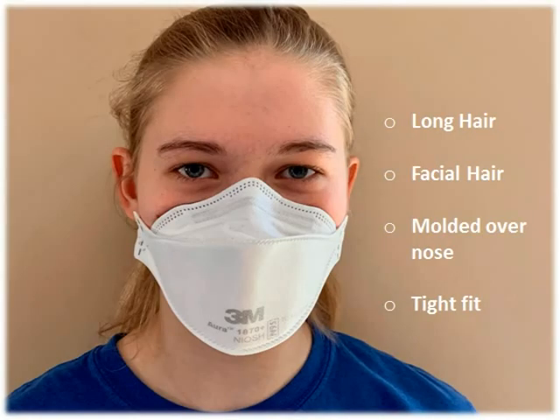A person with facial hair may have a difficult time obtaining a correct fit, and facial hair along the seal lines of the respirator will cause the respirator to leak. The person must be clean shaven, especially along the seal lines. In addition, long hair or sideburns that get under the mask can cause a poor fit.